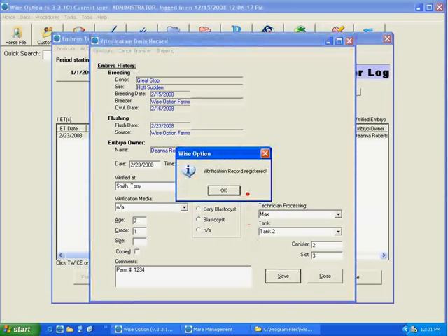The vitrification record is registered. Our inventory log is added to because a log file is kept for each vitrified embryo in the system. And the MM record also received an update, so you're going to see the breeding, ovulation, flush, and in this case, because we didn't put in a recipient mare, we are now sending this to our inventory.